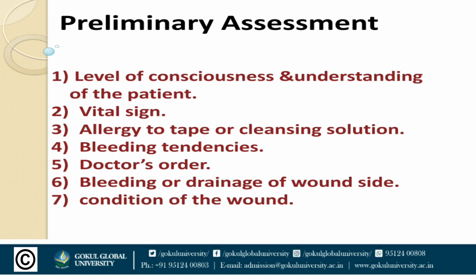Next is vital signs. Check the patient's vital signs like temperature, pulse, respiration, and blood pressure. Next is allergy to tape or cleansing solution. Ask the patient about any allergic reactions. After that, bleeding tendencies. Check the clotting time of the patient. Next is the doctor's order. Check the doctor's order for the dressing procedure.